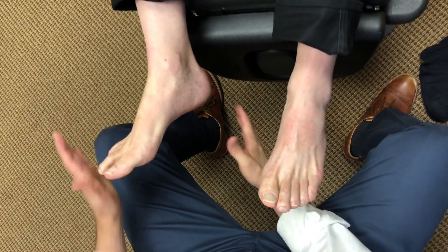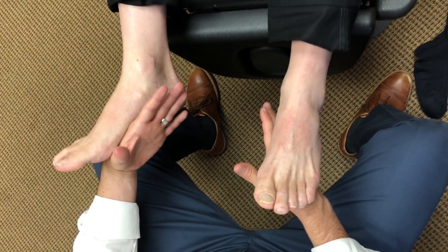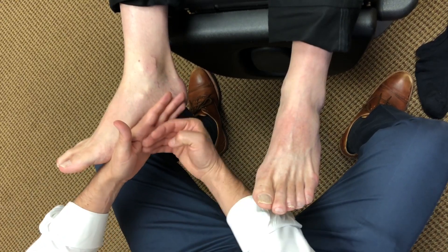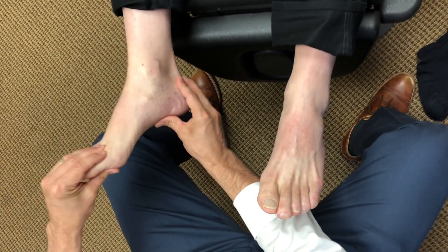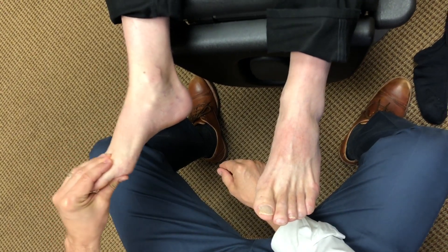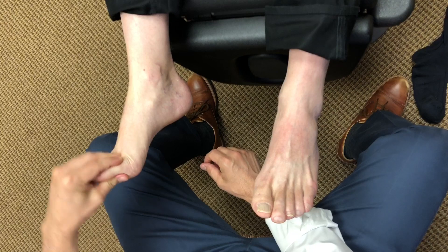What I would do is support this foot, but we don't want to put one thing in this side and nothing on the other. So there's something — just a blank — and then this one has a little bit of support with a little bit of control on the bottom of it. Then we'll accommodate this big toe with a little device called a kinetic wedge, and that'll allow that big toe to drop down. It'll shorten that tug on that tissue, and then you'll be able to regain that big toe extension.